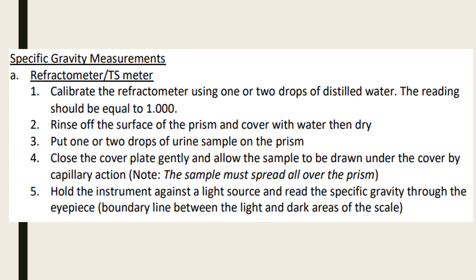Although you can do calibration using other calibrators, like your 5% sodium chloride at 1.022, you add or subtract 0.001, so you have 1.021 to 1.023 when using sodium chloride. When you use 9% sucrose, the reading should be 1.033 to 1.035. And with triple distilled water, you have it at 1.000.